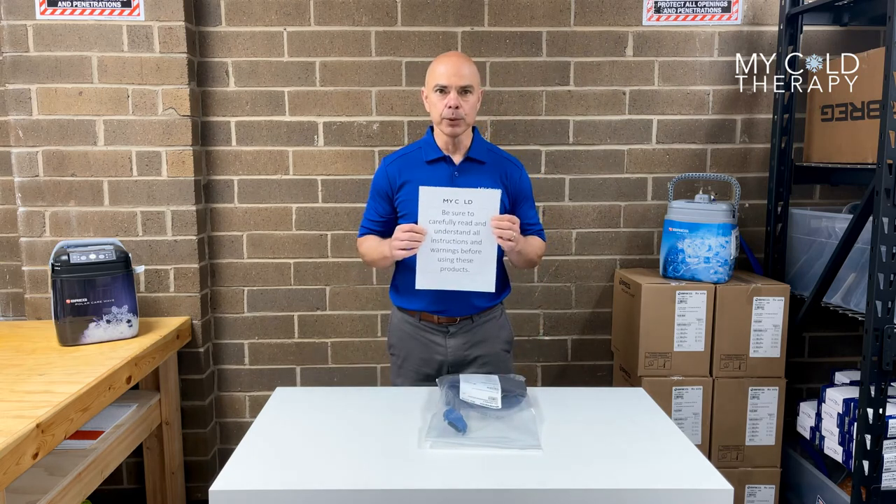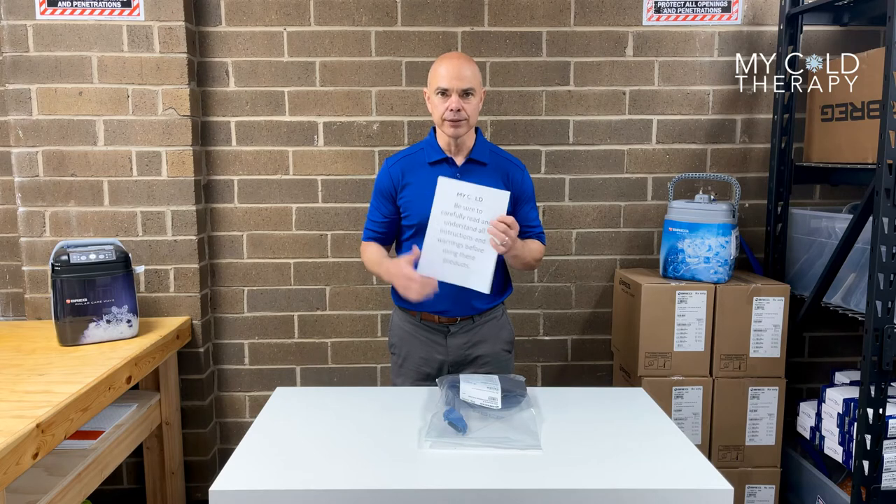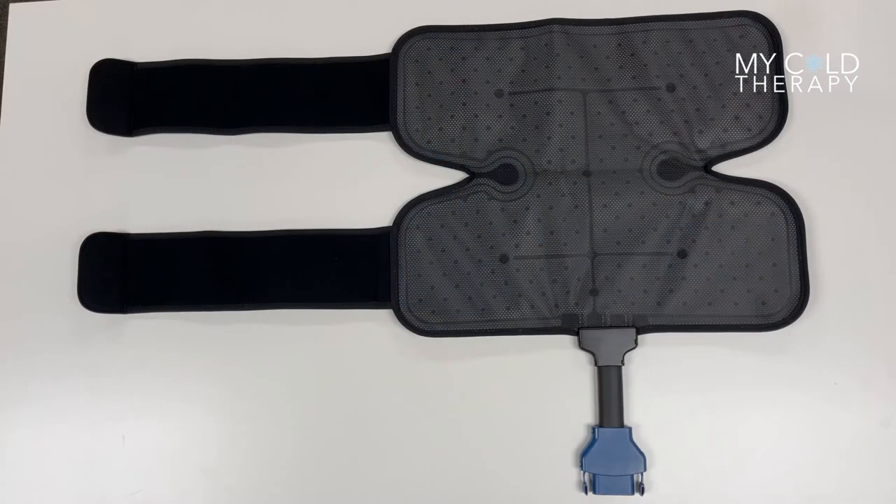In the box, it's going to come with — please read all the warnings and instructions to make sure you know how to use the machine. And now we're going to talk about the dimensions of the pad. These are the dimensions for the Breg Polar Care Wave Knee Pad.